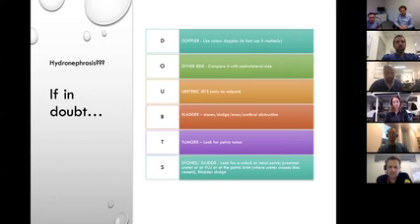And look at the bladder for any stones or sludge that could be a cause for this hydronephrosis, or look at the pelvis for tumors or something pressing on the ureters. And actual stones, you can look at the proximal ureter, intracalyceal areas, or the distal ureter, almost at the VUJ level. Or, interestingly, you can see the ureter crossing over the iliac vessels at the pelvic brim. Very easy to pick up the common iliac arteries and vessels. The ureter crosses over, whether it's dilated or not. So that's another spot you can look at.